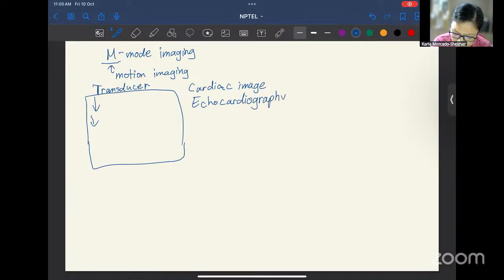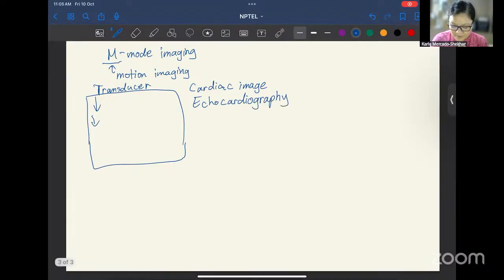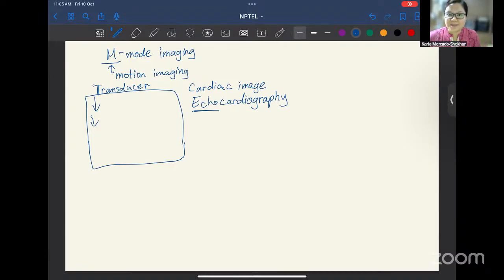In the hospitals, if someone gets an echo, typically it is assumed that the echo is about the heart. Echocardiography is not to be confused with ECG, which is electrocardiogram. It's not really ultrasound related, but a measurement of the electrical differences in your body. So not ECG.